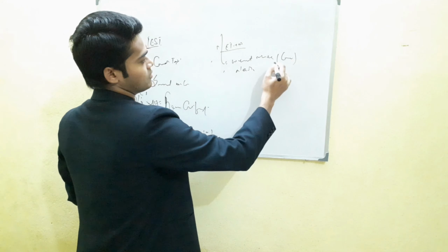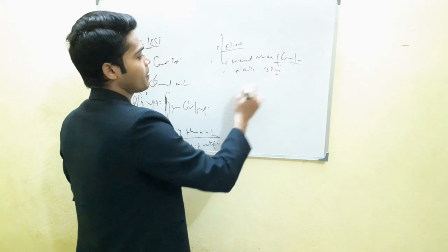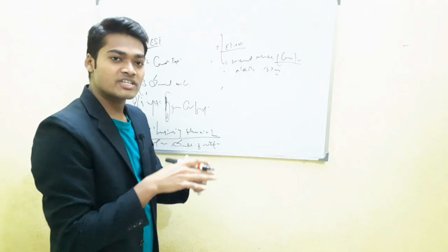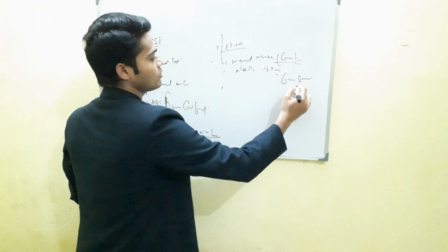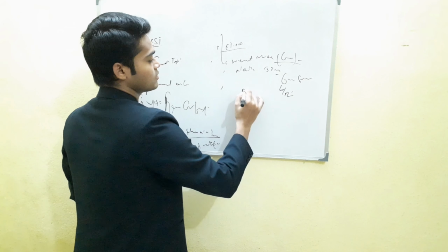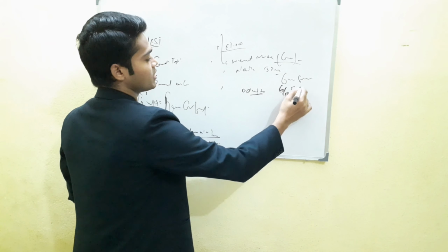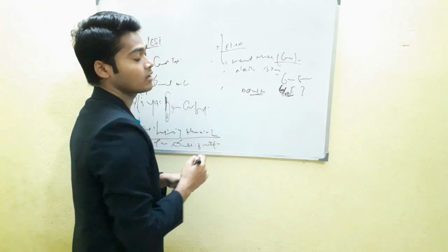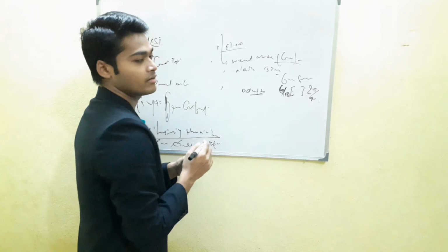It must be visible up to this extent, the 33 centimeter. Now if the patient is an adult, you can give the 6 by 12 letter or 20 by 40 letter, right?